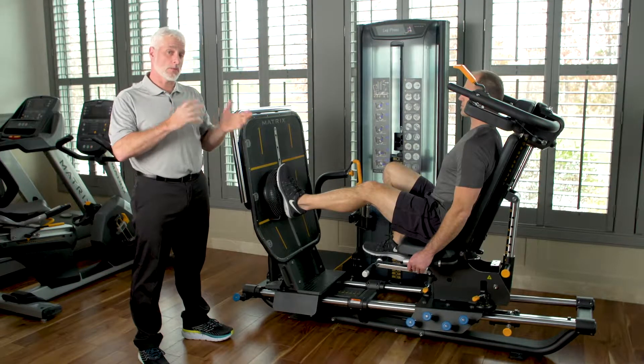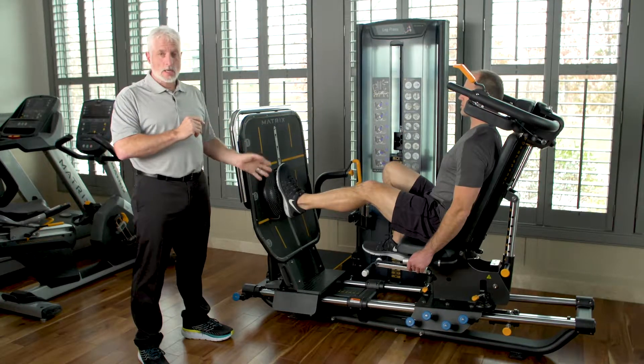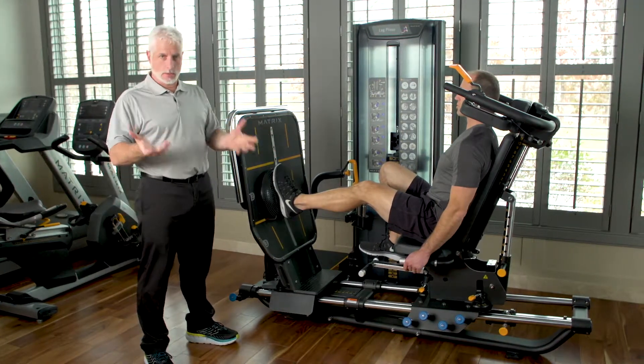With this machine, once you use the foam for quick perturbations of the muscles around the joint, you can now use the disc. The disc provides even more perturbation around the joint, better proprioception, better coordination for the joint, and also through the knee and hip as we all know.